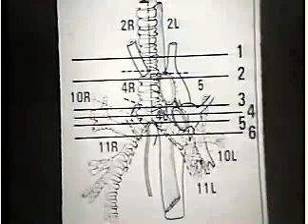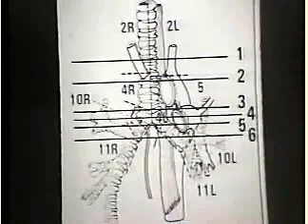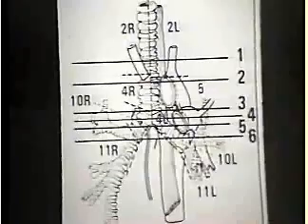In another talk, we will discuss the meaning of these other numbers, the lymph node regions, and their role in management of carcinoma of the lung. I think that CT has greatly enhanced our ability to analyze the mediastinum. The ability to distinguish vascular from non-vascular structures, whether contour forming on the chest film or not, has been extremely valuable. Now, for your purposes, I think it's very important that you spend time analyzing some thoracic CT scans with the accompanying chest films in hand until you're comfortable with these anatomic structures.